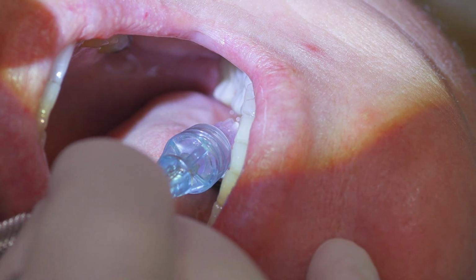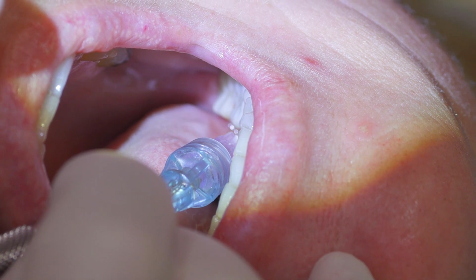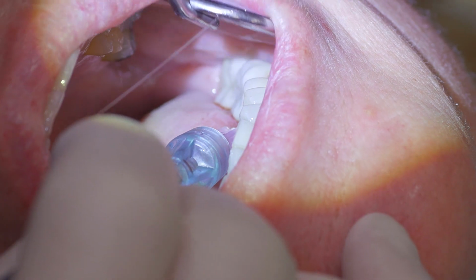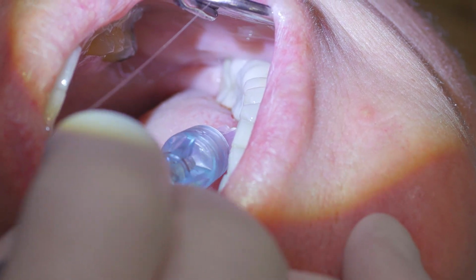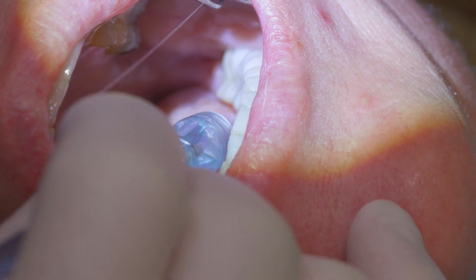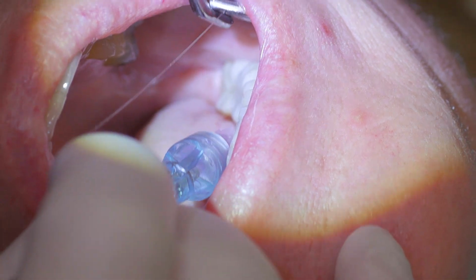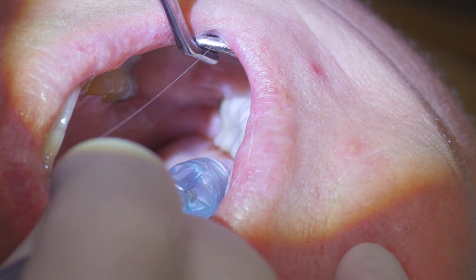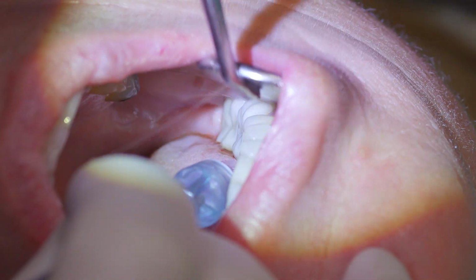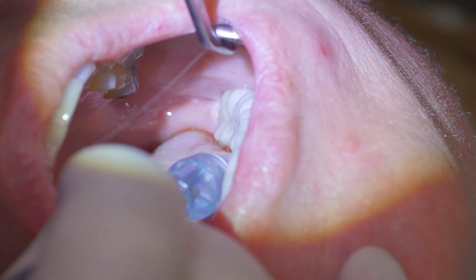When giving the PDL injection, we also don't want to forget to bend the needle a bit at a 45-degree angle and have the bevel of the needle against the root of the tooth. So when you insert it into the sulcus, it's leaning against the tooth, and with the bend in the needle, the anesthetic is going to flow better down into the periodontal space.